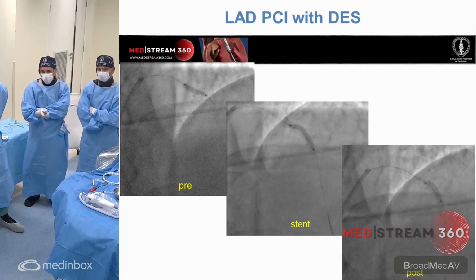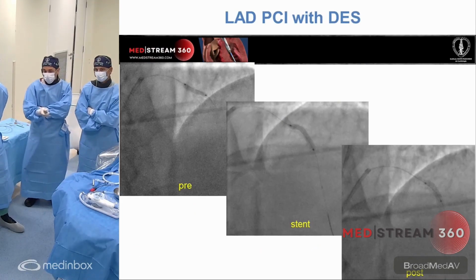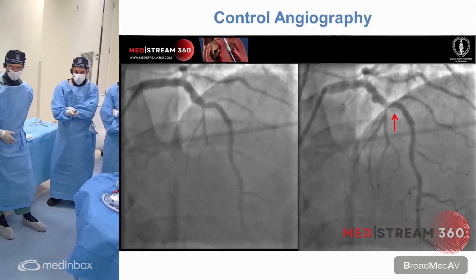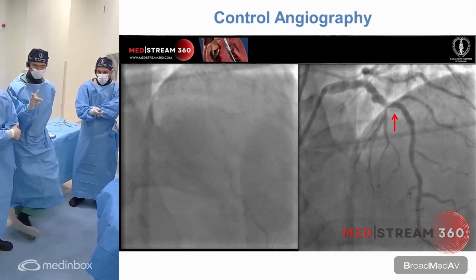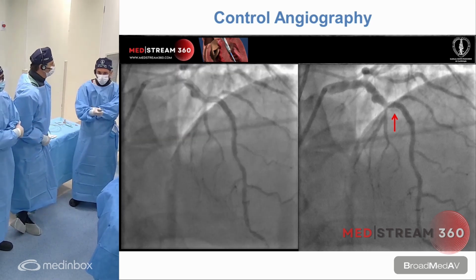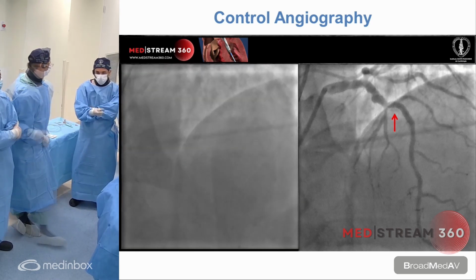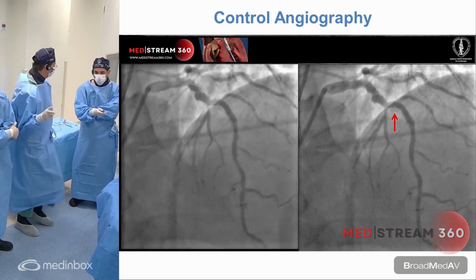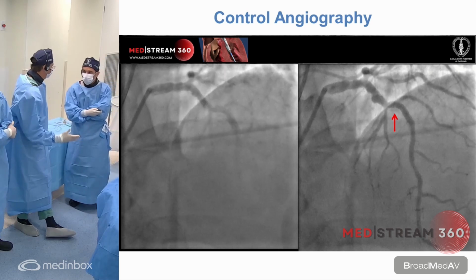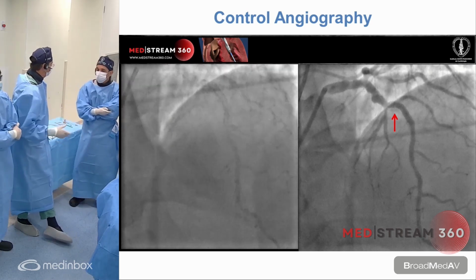So he underwent PCI with a drug-eluting stent at the mid-LAD, and as you can see here, with a very good result. Did you protect that small branch, that diagonal branch? Should we do that, Rodolfo? No. So do you think we could do, even in an ACS patient, to proceed to the RCA with the same procedure?